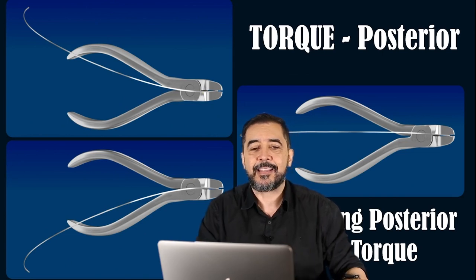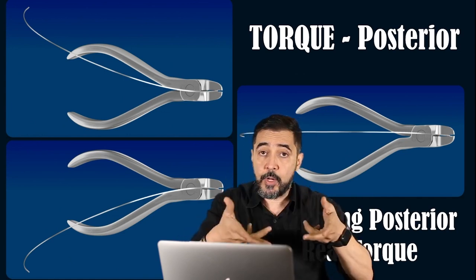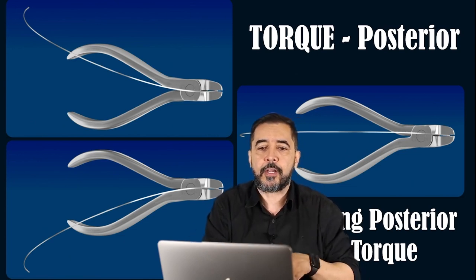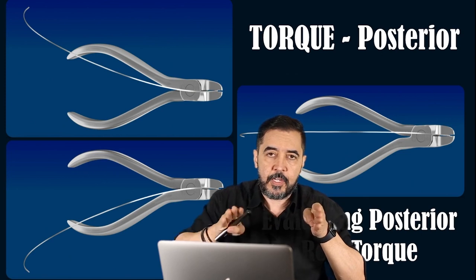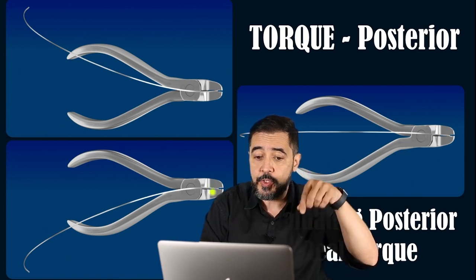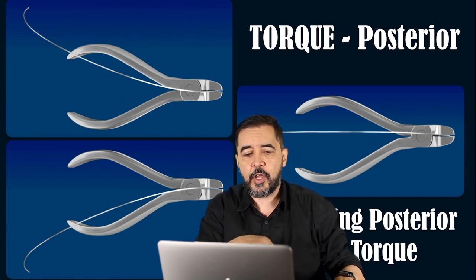I'm just saying that in the average situation, when I do this kind of torsion, a real torque, we will have a positive inclination to the buccal, and here, if I'm using it in the upper arch wire, I'm having a negative inclination.